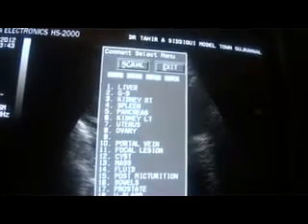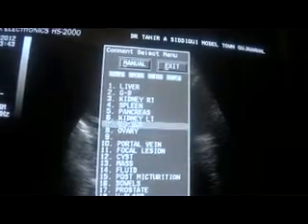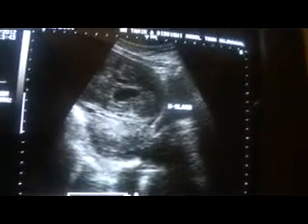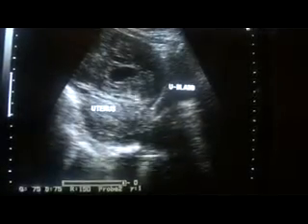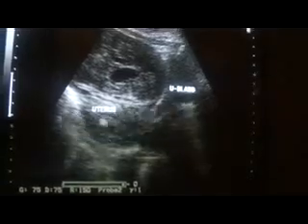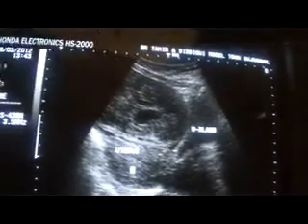And anterior to the uterus, we see a collection in the center of which a cystic area is seen. Now this is the cystic area, and around it you can see a mass-like area, echogenic, of mixed echogenicity.